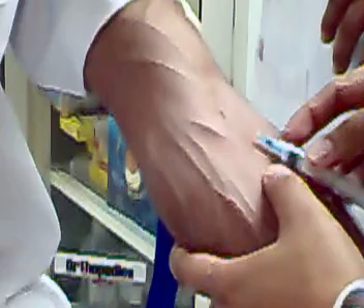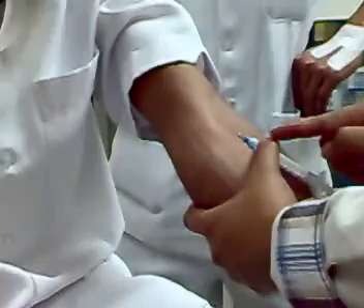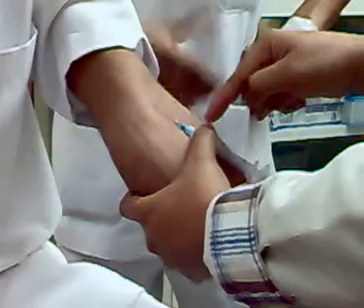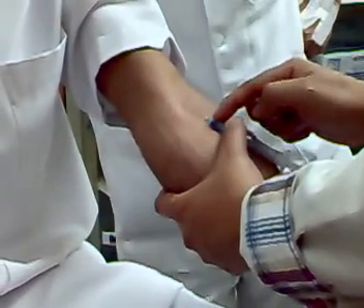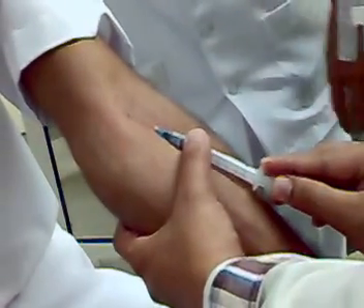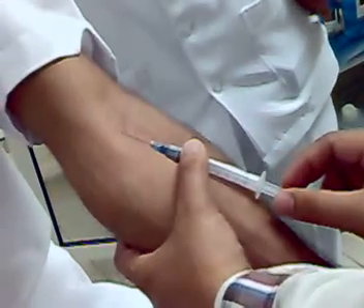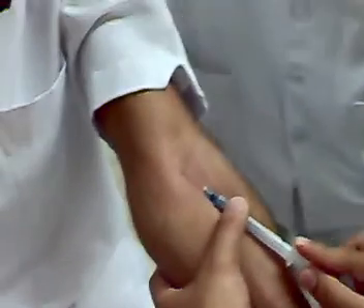As you see, I will see the blood flow here. I have to remove the tourniquet now to let the blood flow freely. See this finger? Remember this finger — I'm holding because if the patient moves, this will fold up. So you have to stabilize the syringe with your thumb. I will withdraw some blood now. I will not withdraw it like this because I might remove the needle — withdraw it like this.